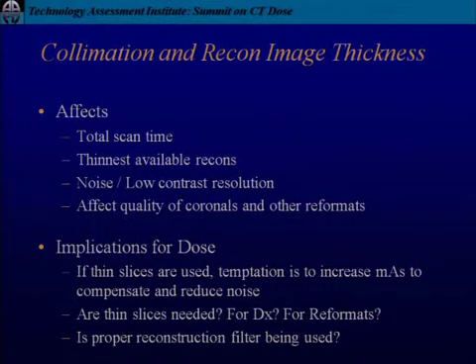Just following up on that comment, that's one of the reasons that the ACR accreditation dose testing got difficult for us, because as the beams got wider, the vendors recognized, don't make axial thin images in that wide beam because the edge ones look terrible. So we're going to disable that mode because we don't want to use it clinically. And then we go and try to do dose there, and we can't. So they've tried to keep clinical errors from happening, but it makes the physics testing difficult.